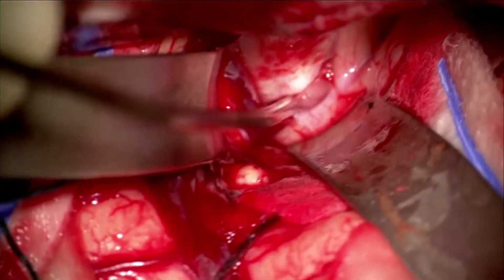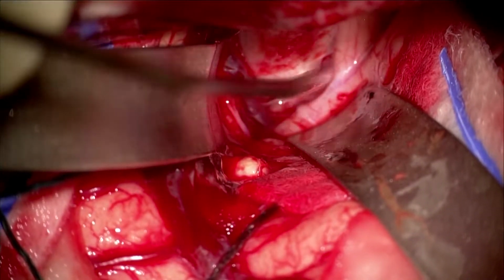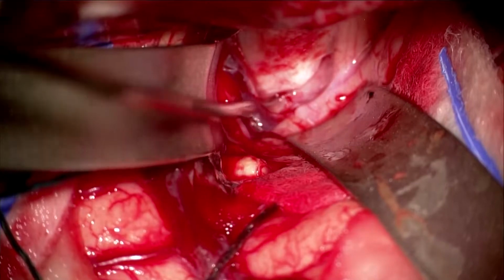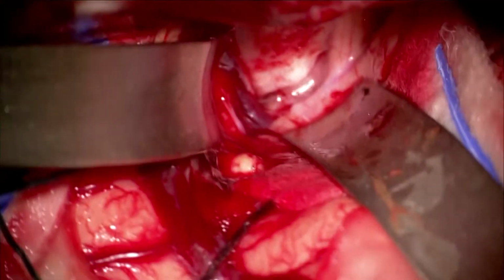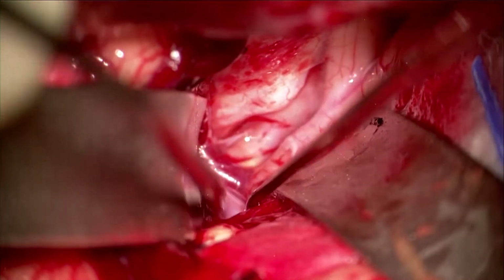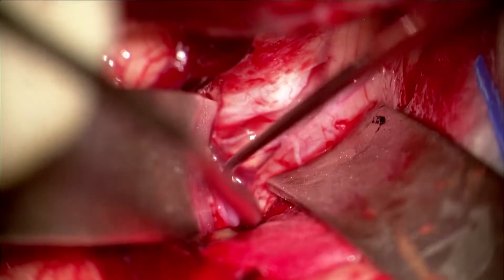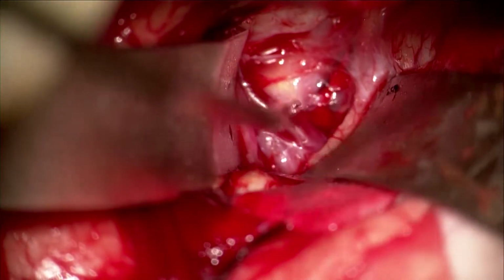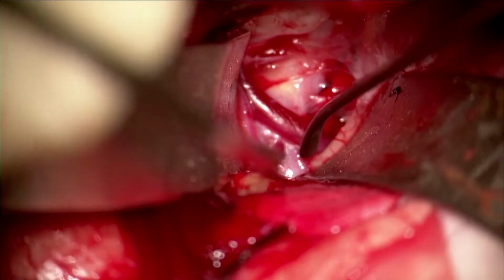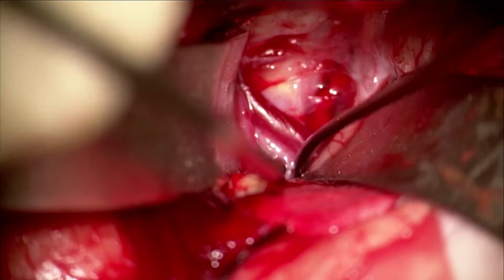I'm continuing to work near the carotid artery in order to make sure that if indeed the aneurysm does burst during the procedure, I will have the ability to control the blood flow in front of the aneurysm by closing that down with a temporary clip if need be. Here I'm further exposing the arteries that lead to the aneurysm, and the aneurysm itself you can see just underneath my sucker with the very white dome.